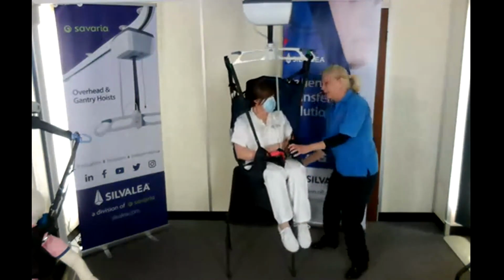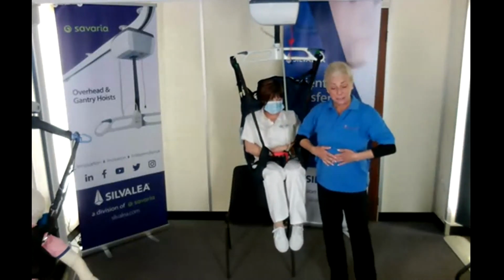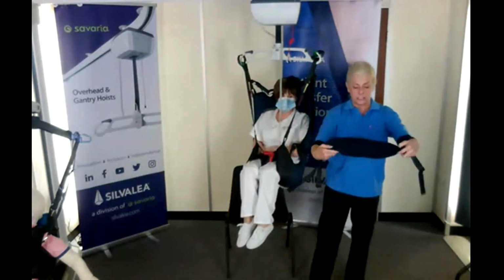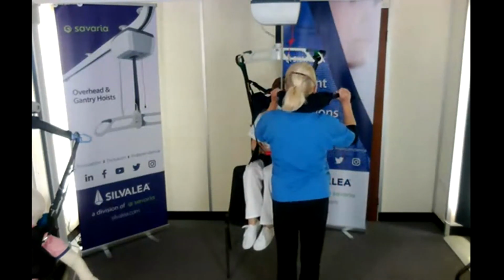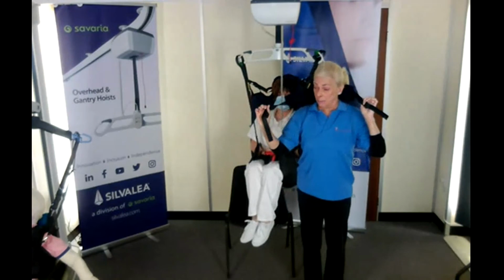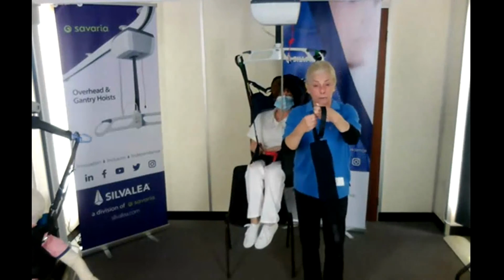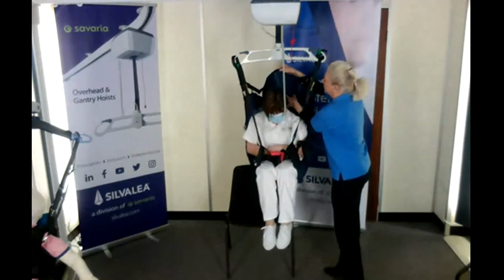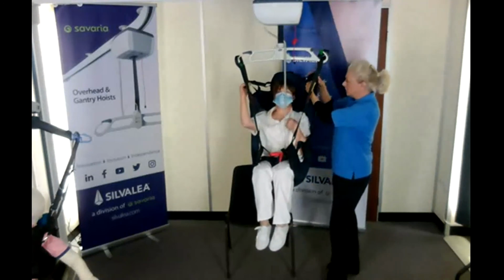We'll talk about the cushions, Andy. Can we have a chest support? We can add things to it. Certainly, if you need chest support to keep it in place. The other thing that we can add is a neck roll. Neck rolls are quite nice just to support the neck, rather than a head support forcing the head forward. So that's quite a nice addition. It can be moved to the side if you've got someone leaning, and they just clip through, hook through onto the shoulder tape here. So we just slide that behind Jim's neck. It might give more comfort to that neck area there, and then just clip it onto there.